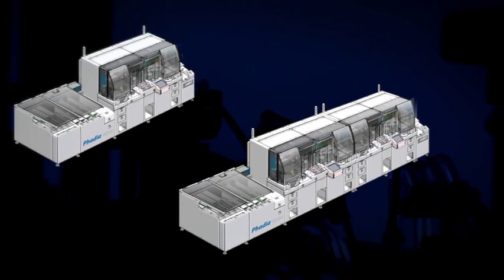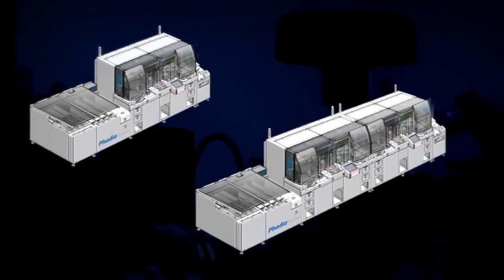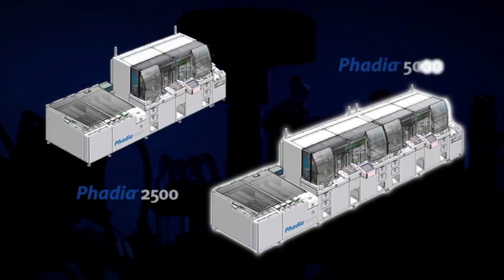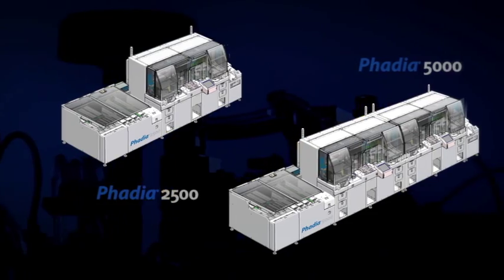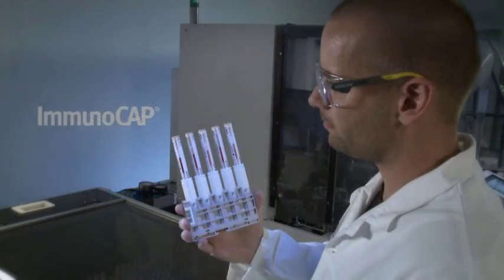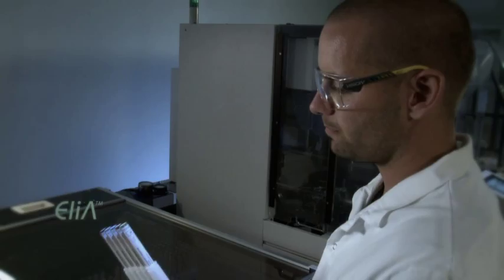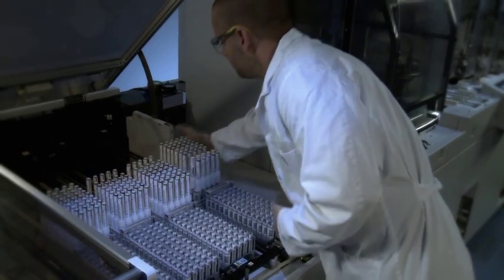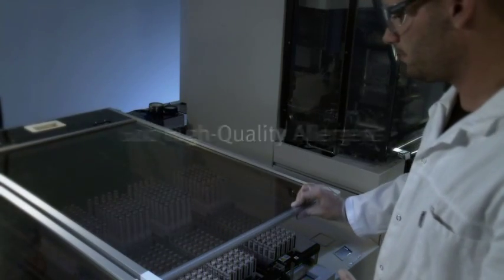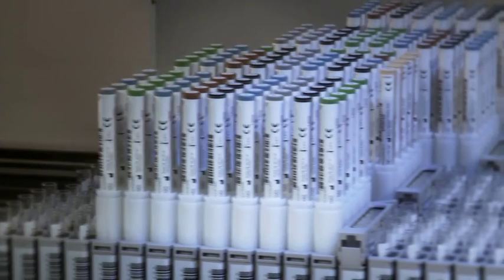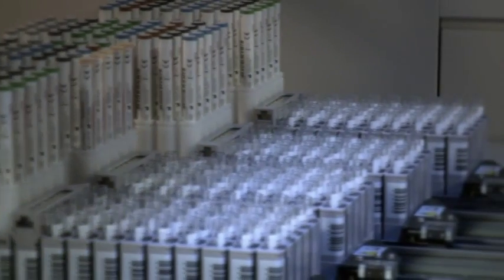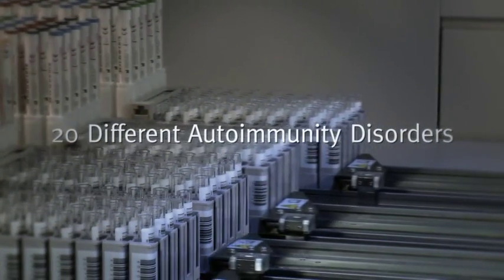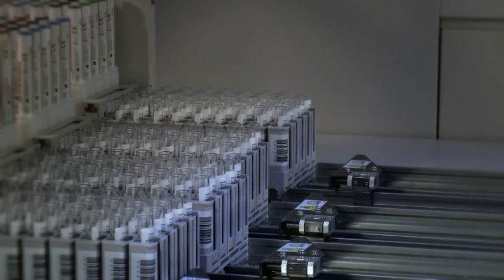Optimized to run high volumes of premium tests in allergy and autoimmunity, the all-new Phadia 2500 and Phadia 5000 can revolutionize your lab. It's now possible to run ImmunoCAP allergy tests and ELIA autoimmunity tests on the same system, with support for running over 600 standardized high-quality allergens, 80 allergen components, and antigens for more than 20 different autoimmunity disorders. The instruments offer incredible flexibility.